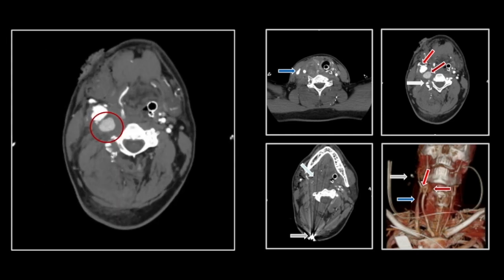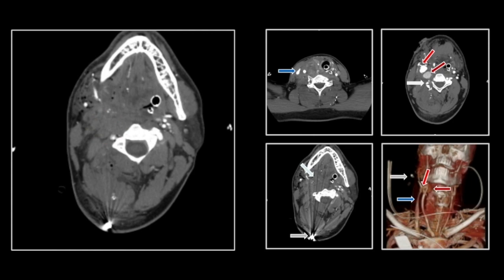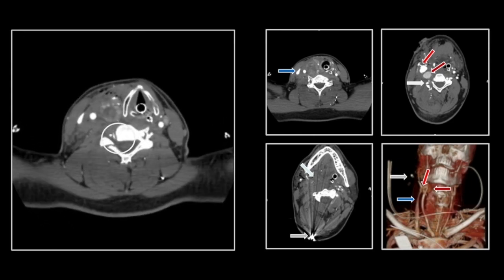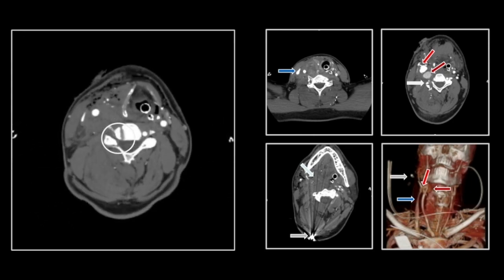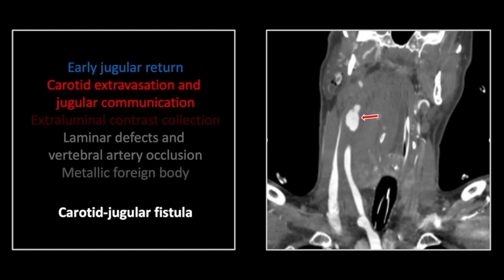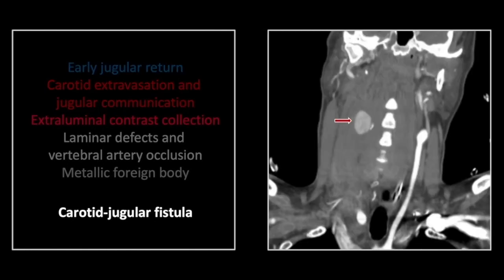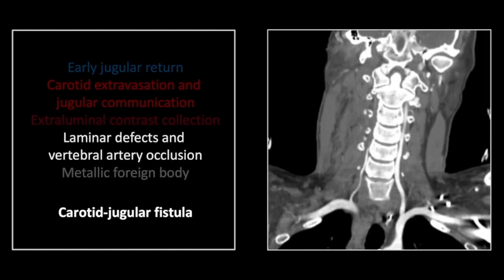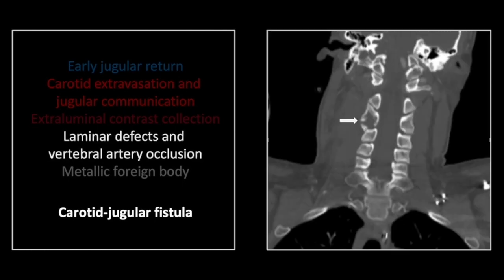The second lobe of that bilobed pseudoaneurysm is visible there. More posteriorly, you can see the damage to the vertebral column and the absent right vertebral artery contrast column. Here is the offending bullet trapped beneath the skin in the posterior cervical soft tissues. Note again that early venous return. The second lobe of that bilobed pseudoaneurysm is visible, and let's note that vertebral artery contrast column which we lose right there. On the coronals, you can appreciate again the early jugular venous return.